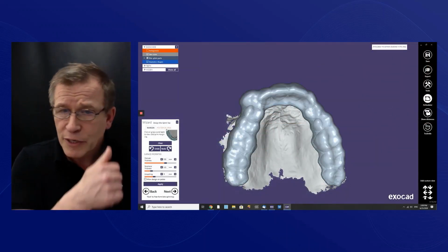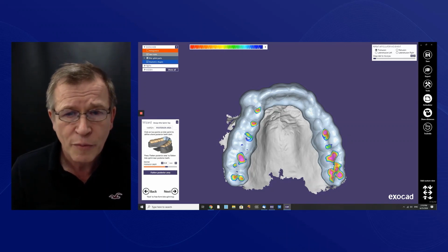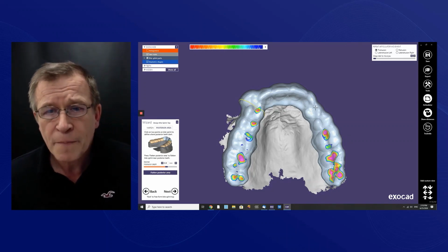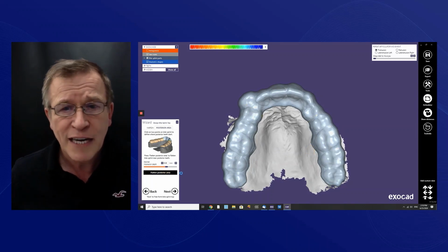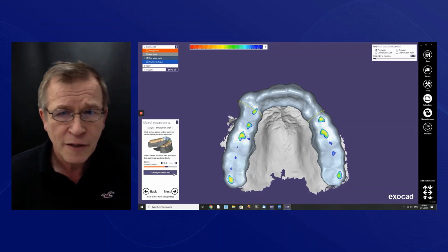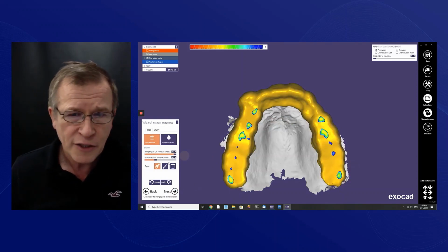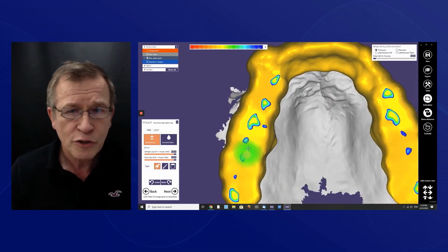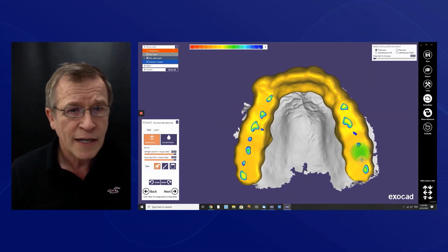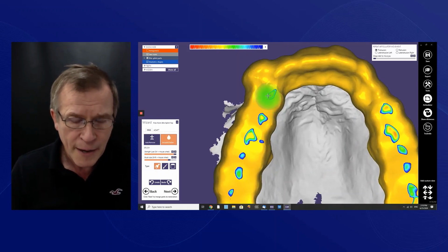Another cool thing that we can do is take the scans for what we call a 3-piece splint. That takes a little bit more knowledge than I have for the design. So I'm able to take those scans, and this was sent to one of my lovely Romanian colleagues, Irina, and she would do the design for me. I can check the design, make sure everything's just the way we would like, and then she'll send it over to me. And again, we can print the splint.